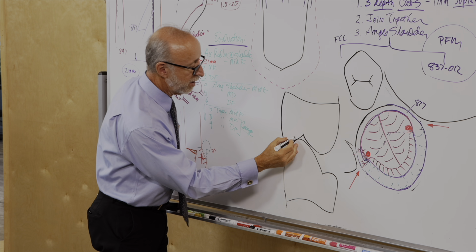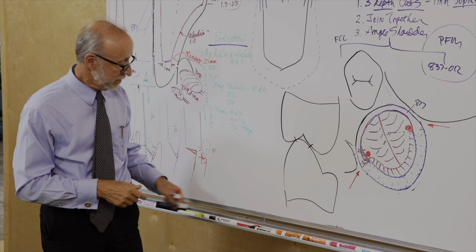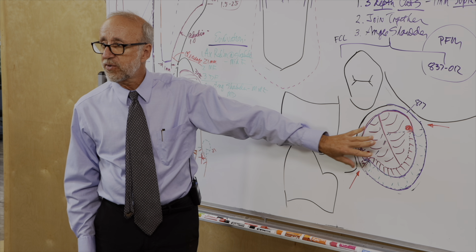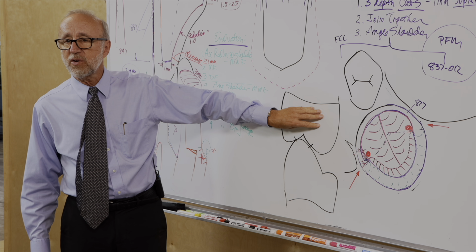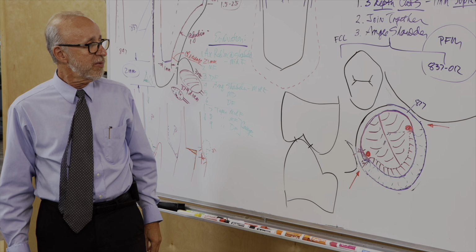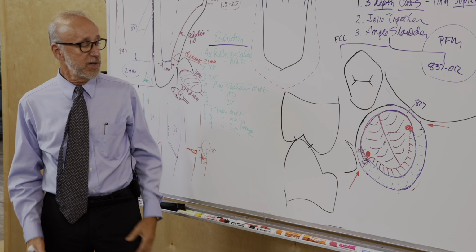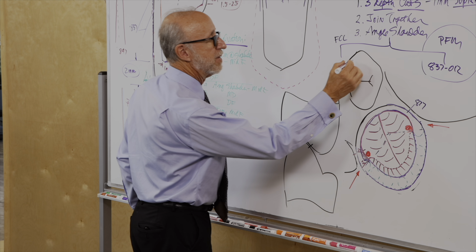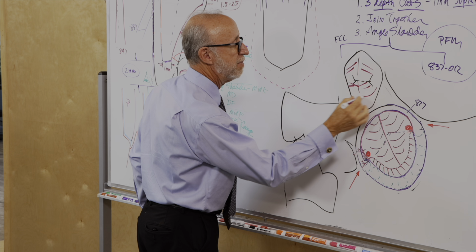All right, so we're going to do a quick discussion about premolars, maxillary and mandibular. Based on the discussion we've had for the canine, we should be able to figure out pretty quickly what to do about premolars and basically all the posterior teeth. With the premolar, we don't have the more complex anatomy of the molars that we've been working with the last few days. So we know a little bit about premolar anatomy. There's going to be a couple of ridges, a couple planes, and a C-plane around through here.